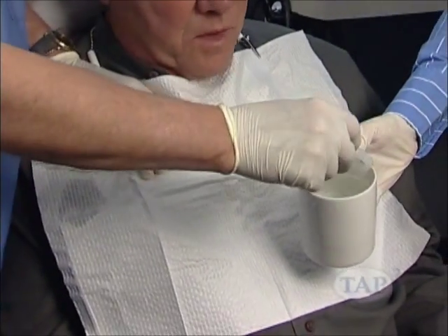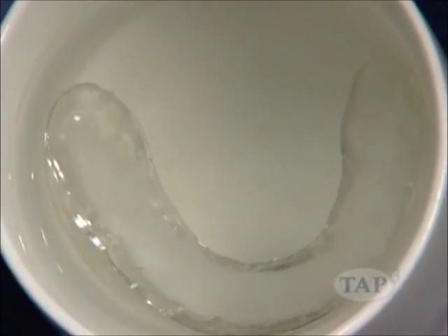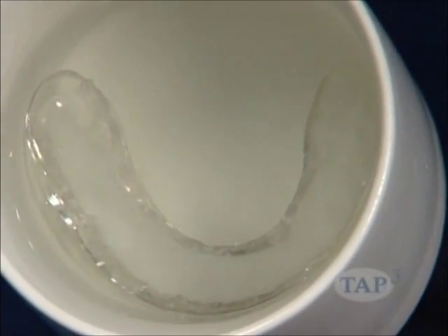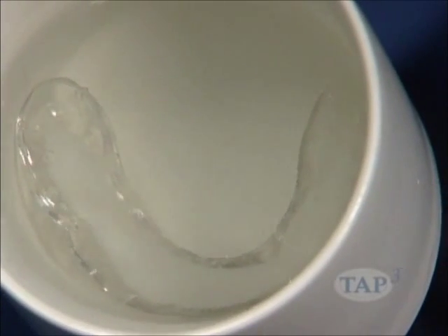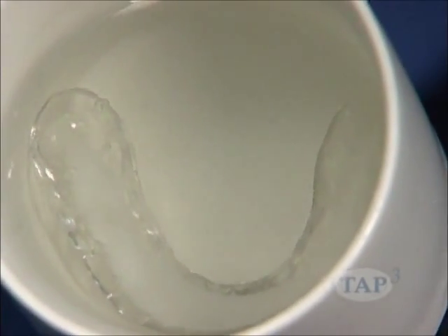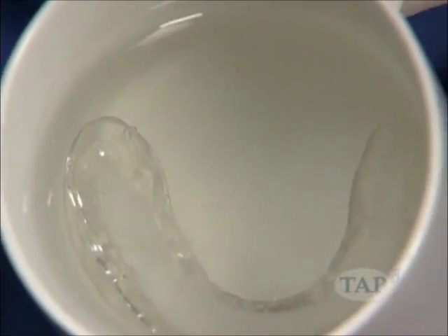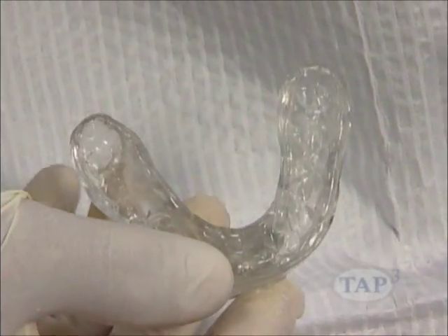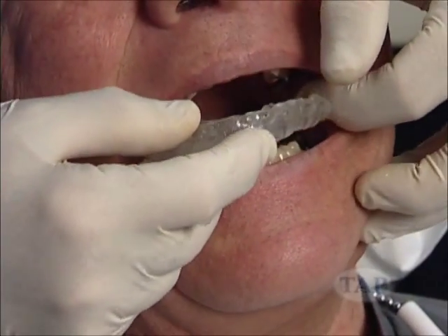To fit the TAP thermocryl, heat one tray in hot water until the thermocryl turns clear and becomes soft. Do not use water hotter than 160 degrees, or leave the tray in hot water after the material turns clear. This may cause the tray to warp. Once the material turns clear, remove the tray from the water. Place the tray in the patient's mouth immediately.